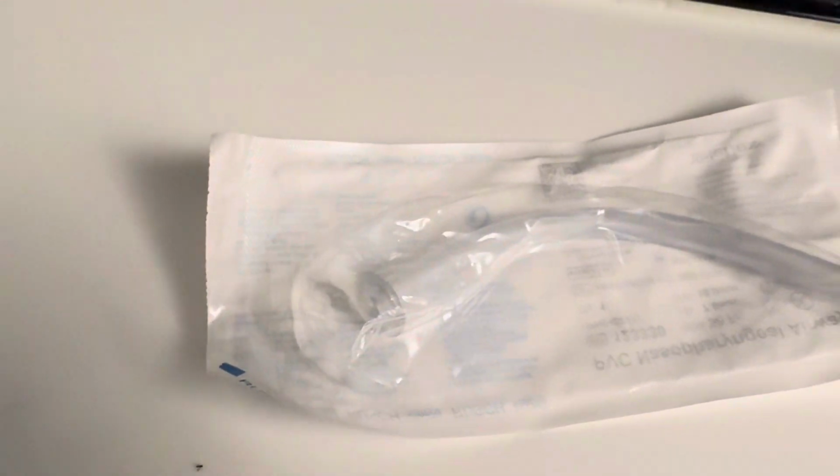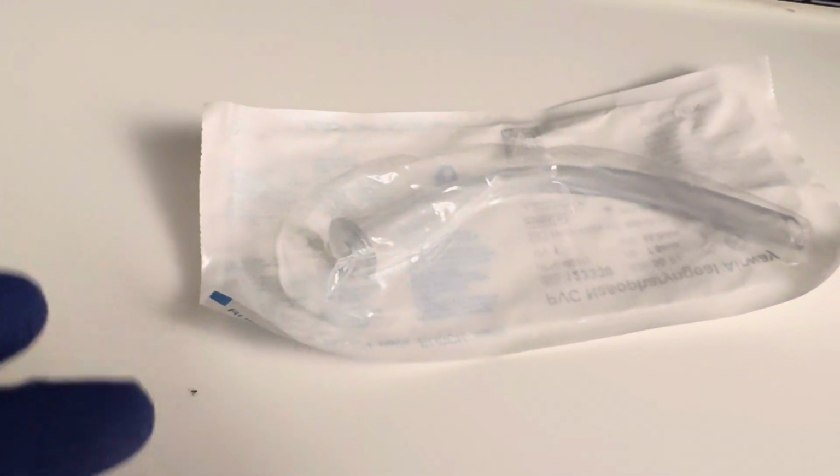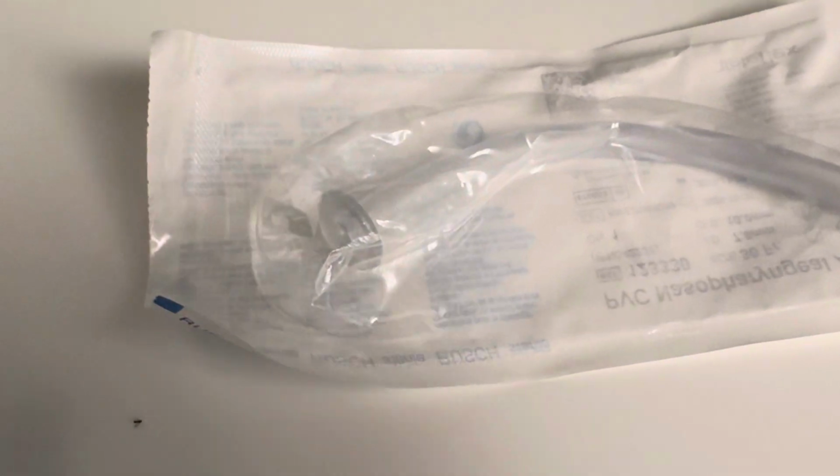So I'm about to place one of these nasopharyngeal airways inside of a patient because he needs frequent suctioning. In order to do frequent suctioning, we have to go down with a 14 French catheter. This just makes it a little bit easier to go into the patient's airways without causing a lot of trauma.